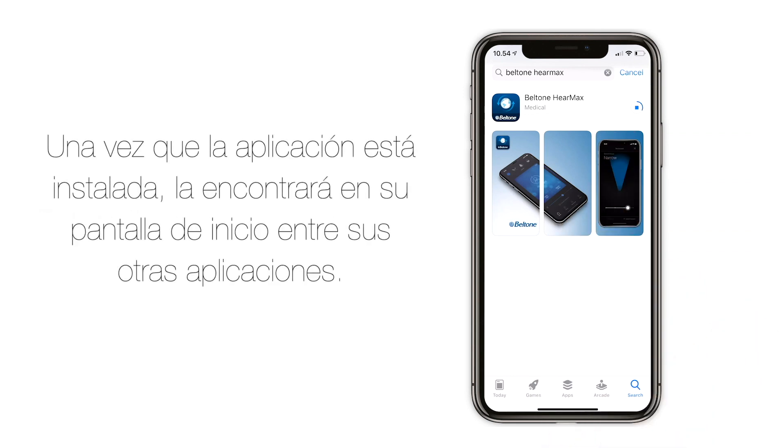Once the app is installed, you can find it on your home screen among your other apps.